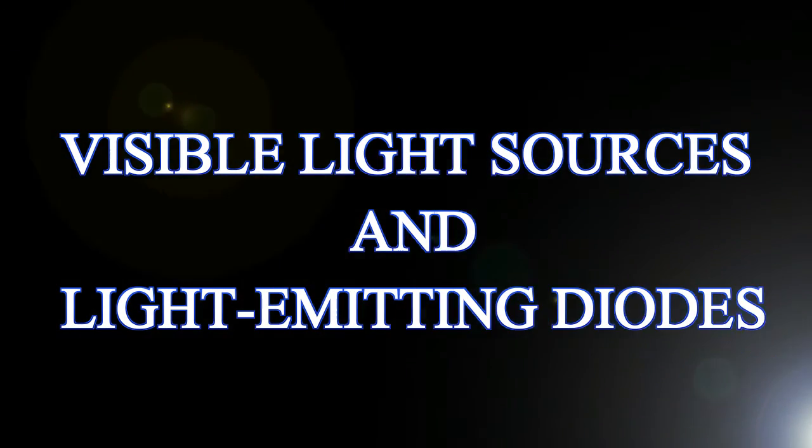Visible light sources and light-emitting diodes. Visible light sources were some of the earliest light-based systems used in the treatment of acne vulgaris. Originally, blue light devices were introduced and subsequently gained FDA approval for the treatment of this condition. Later developments in this field include the advent of blue and red LED panels, with the latter device used off-label in the US for this indication.